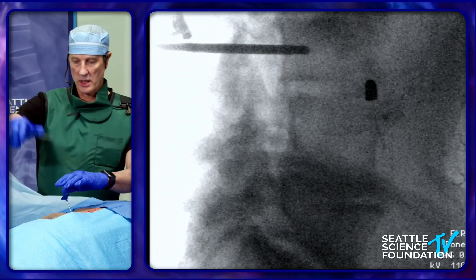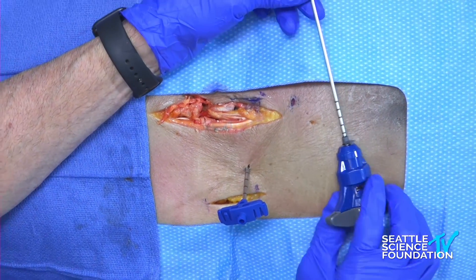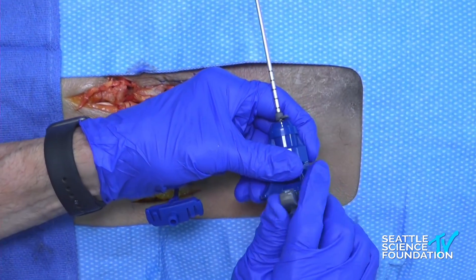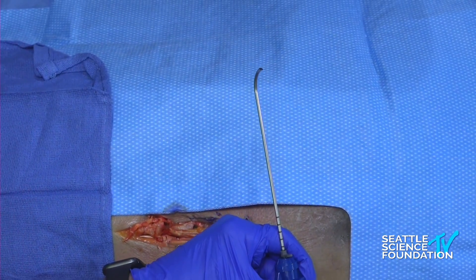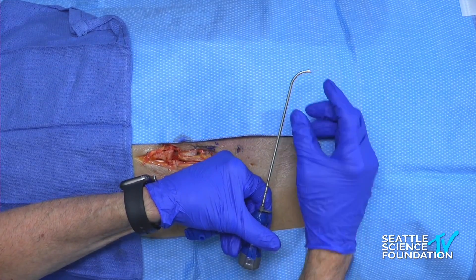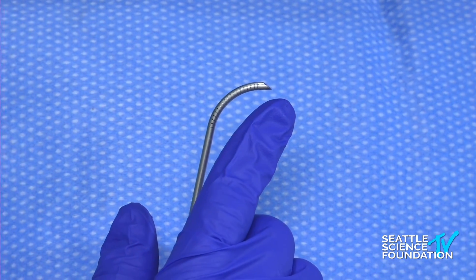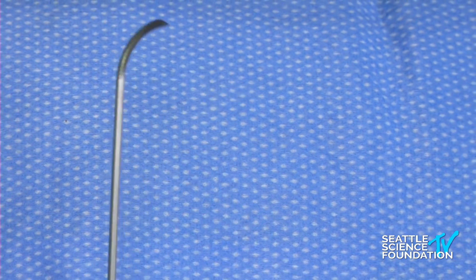So I'm going to take the stylet out and take the power curve. Let me demonstrate one thing. This is a directional indicator, and the arrow is pointing this way. A clockwise turn rotates the power curve tip almost 90 degrees, and it does so by steerable internal stainless steel cables. It has a bevel here, and the steering goes the same direction — it accentuates the steering away from the face of the bevel and toward the tip. The needle will natively go away from the face and toward the tip, and this accentuates that steering capability.